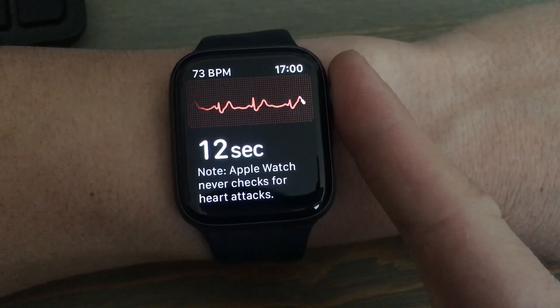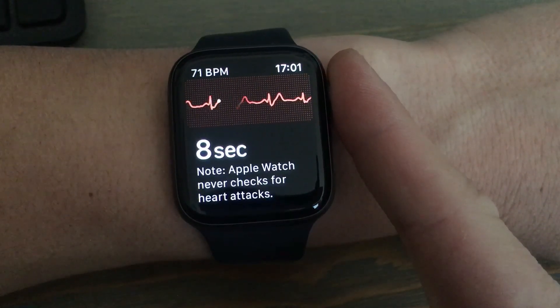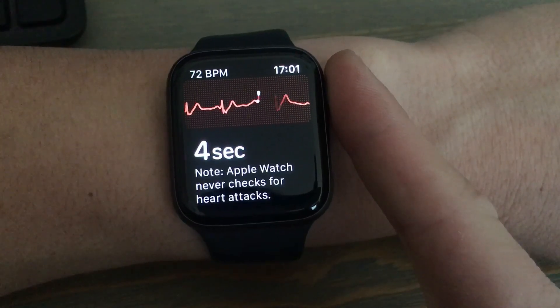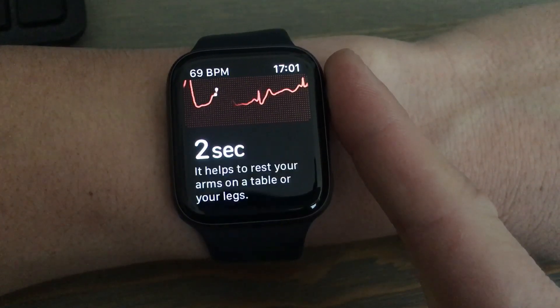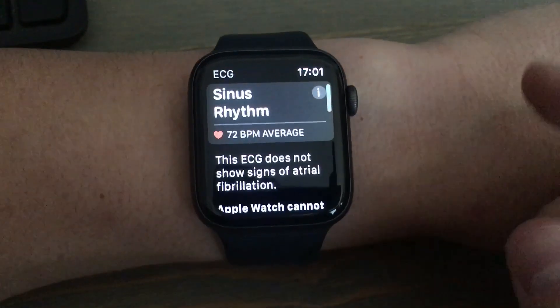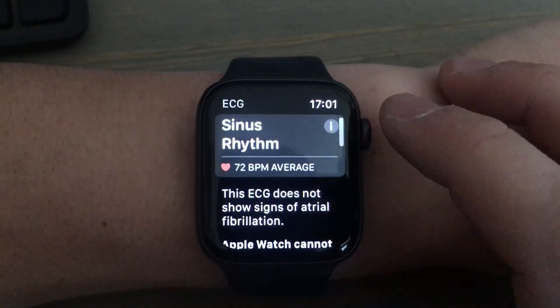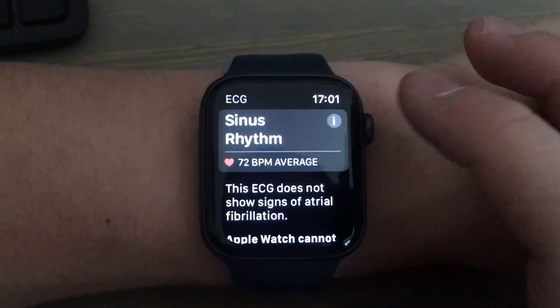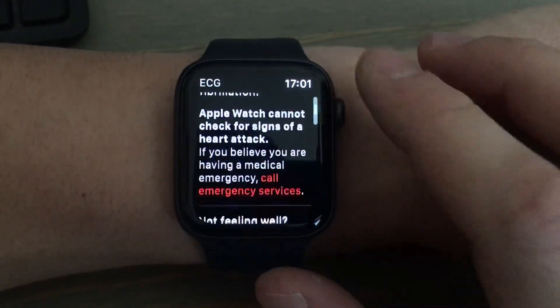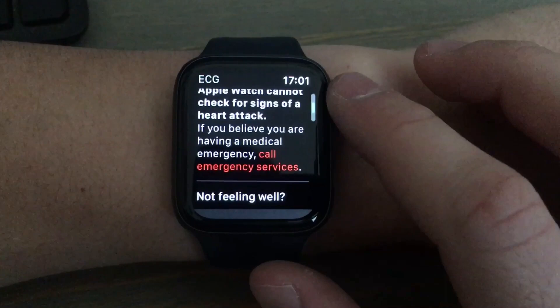And then I can view it on there. You have to sit very still for it to be accurate. It tells me my average of 72 beats per minute.